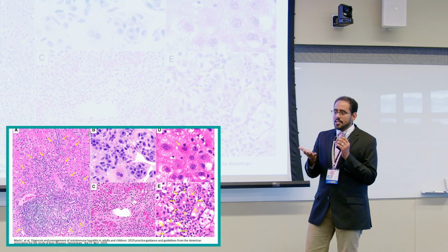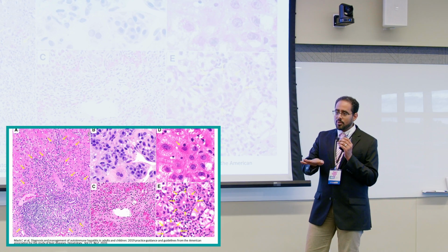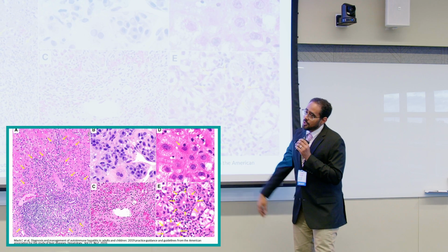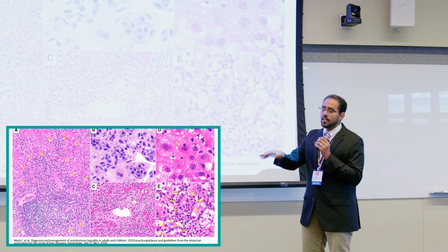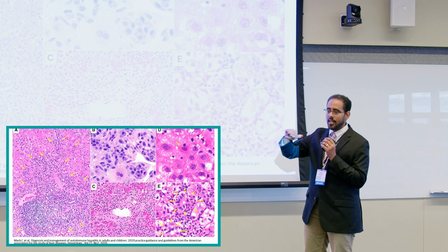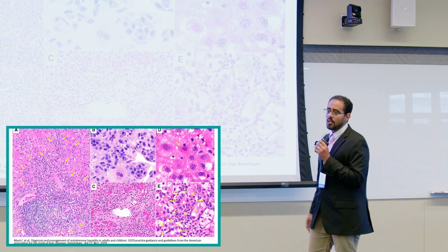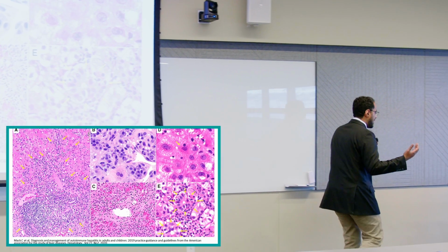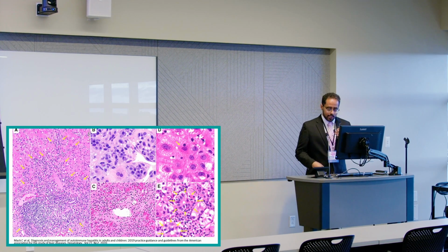And as I told you, the T cells will be attacking the liver cells. But when we take the biopsy out, we freeze the process with formalin. So sometimes we catch, as you can see with the yellow arrow, some lymphocytes passing through the liver cells. They got trapped in the liver cells, and we can catch them in the action. So those are all the features of autoimmune hepatitis under the biopsy. And then we tell the clinician, yes, this is compatible with autoimmune hepatitis.